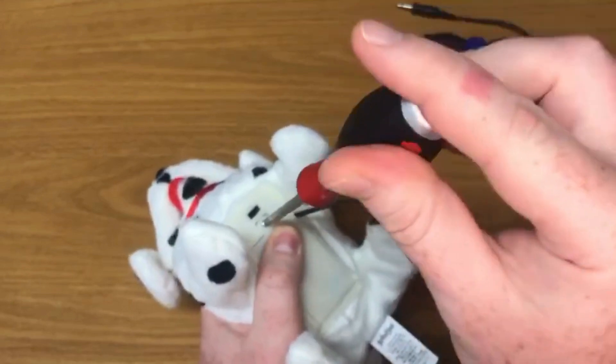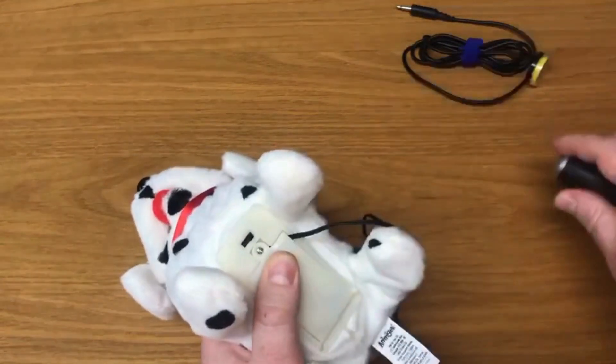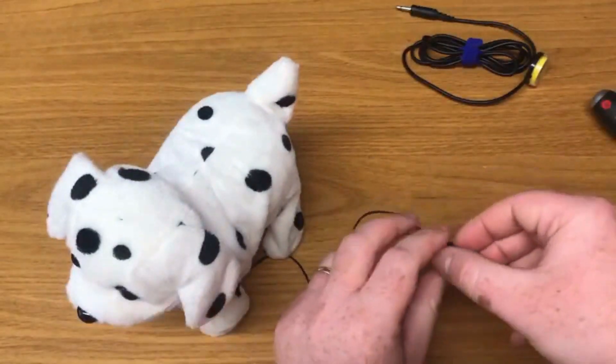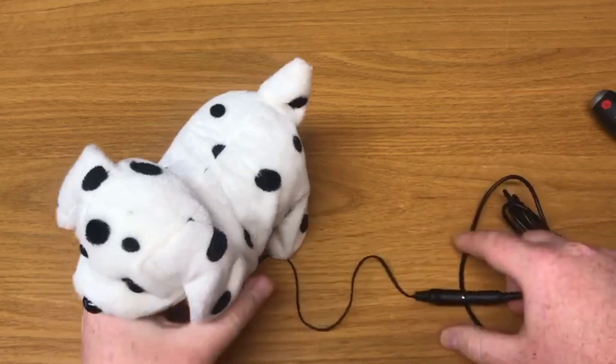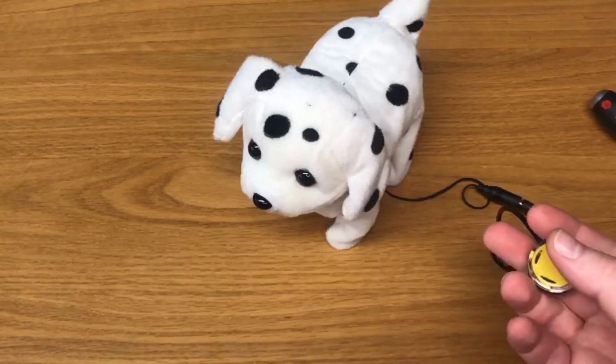If applicable, turn the device on. The toy is now switch adapted. We'll connect the adapter to the switch of your choosing. Set it up here and if you press the button it should work.